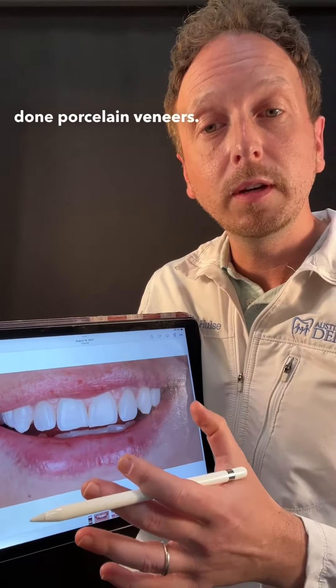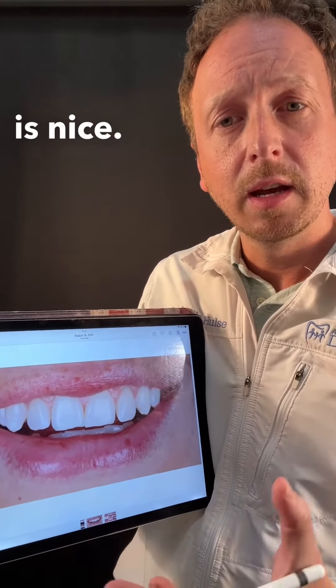So what do we do? We could have done porcelain veneers, but in this case the color is nice and the teeth are relatively healthy. We just kind of need to change the shape and upgrade them.